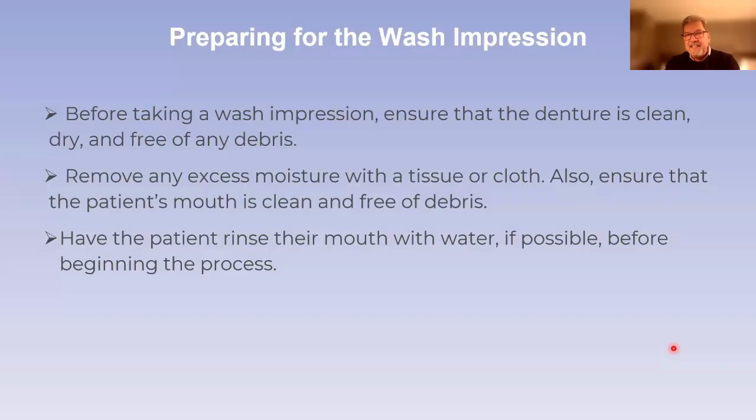So before taking that wash impression, just ensure that the denture is clean, dry, and free of any debris. Remove any excess moisture with a tissue or cloth. Also ensure that the patient's mouth is clean and free of debris. Then have the patient rinse their mouth with water, if possible, before beginning the process.